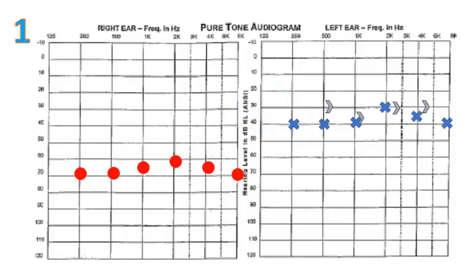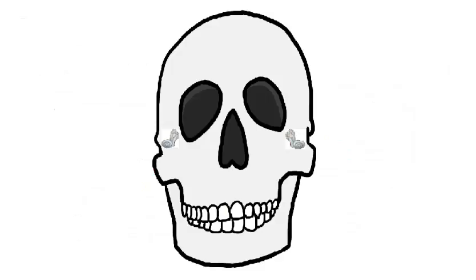Now, the unmasked bone line is not showing any air bone gaps from the left ear. When we see those results connected to the overall air conduction hearing of the left ear, we're allowed to not care which ear they're coming from. We've ruled out any conductive components in the hearing of the left ear. So in this situation, even though we have unmasked bone conduction results measured and we don't know which ear they're coming from, we can still consider our view of the left ear to be fairly complete. In other words, we can infer that there's a sensory neural hearing loss on the left side, and we can rule out any conductive components there.